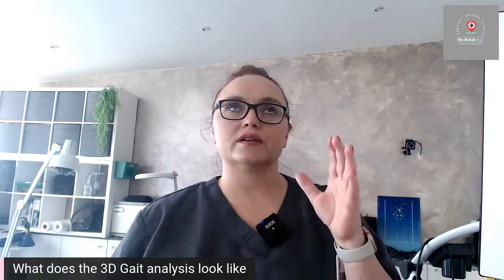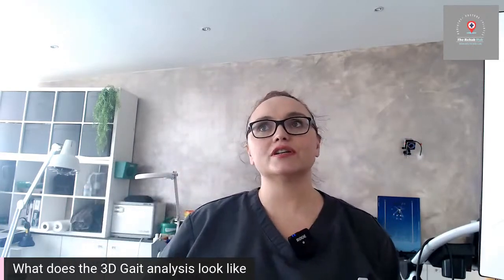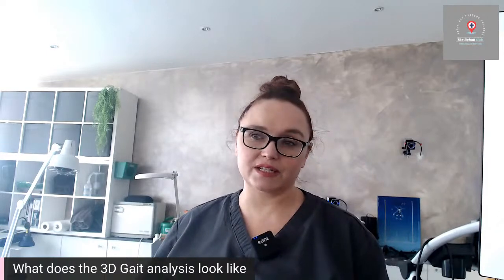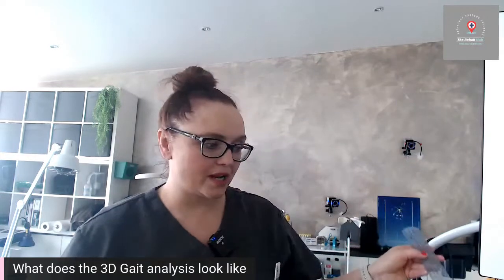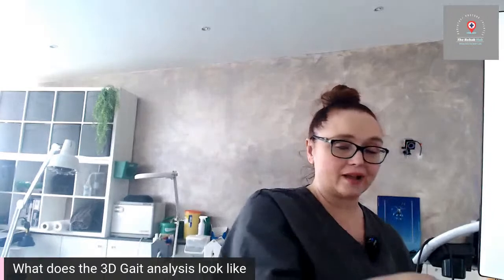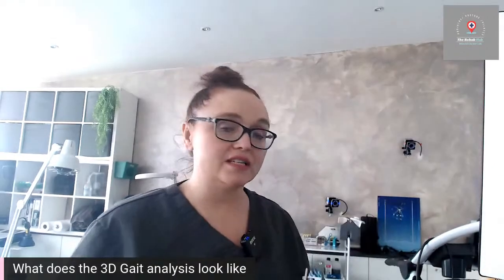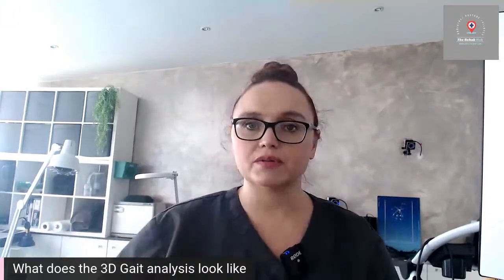We know how the body ideally should function. We know that we need to have about 65 degrees of dorsiflexion at your big toe. We're not going to just guess that you've got that, we're actually going to measure. We know that to ambulate properly, you need at least 15 degrees of dorsiflexion through your ankle joint.